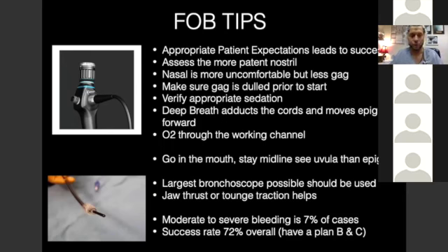You could put O2 through the working channel. You're going to go in through the mouth. You're going to see the uvula. You're going to go around the tongue. You can see the cords. You're going to spray the cords. You're going to go down the trachea.